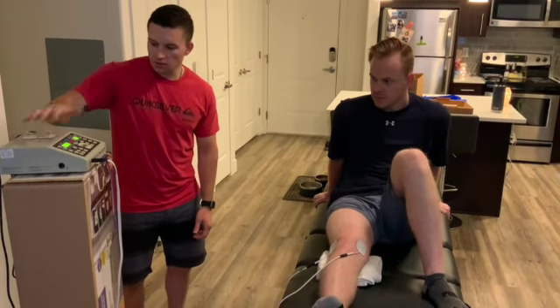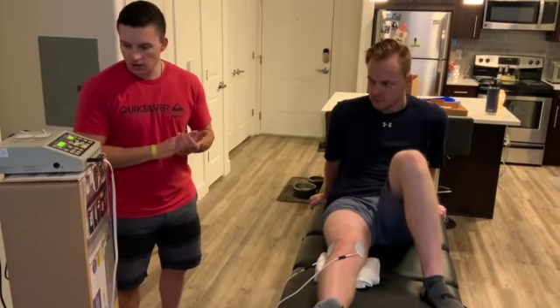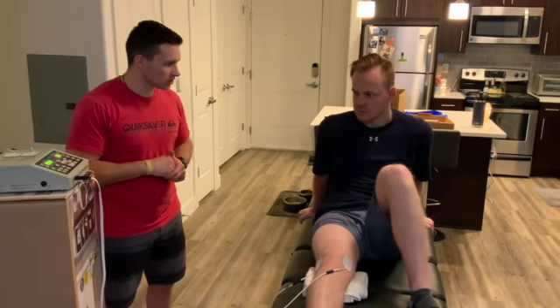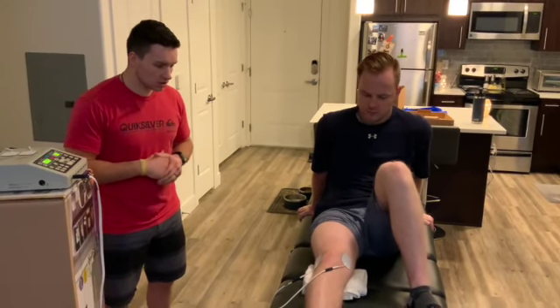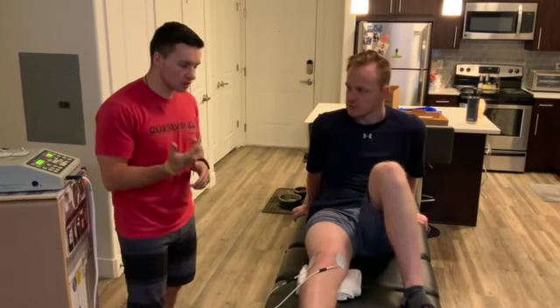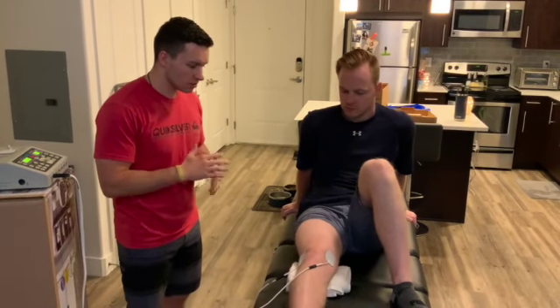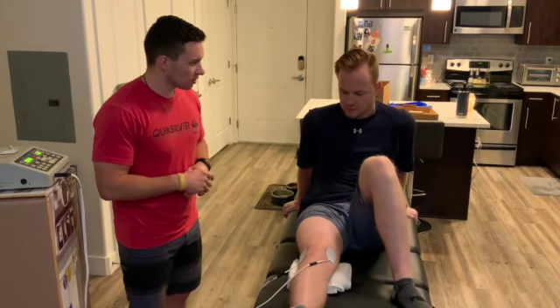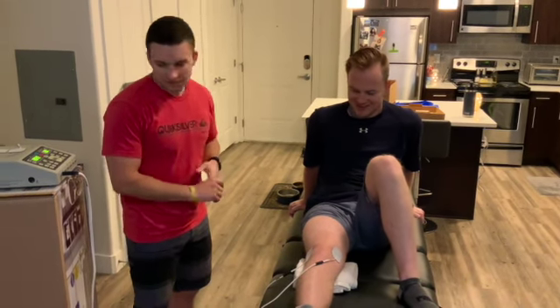I will start this up. We'll go for 20 minutes on here, and as soon as that is done, we'll take you off, okay? Feel okay, not hurting or anything like that? No, that's good. Okay, sounds good. And once we get done with this, that'll be it for today, since we wanted to relieve that pain and everything. Cool. And we'll let you get out of here and get back to life. Sound okay? Sounds good.